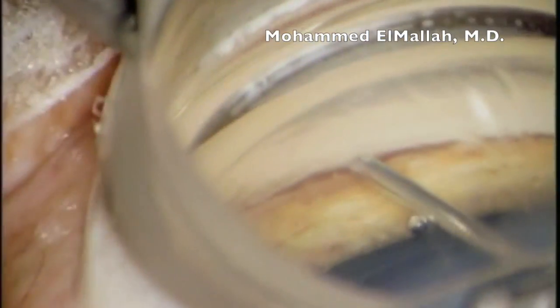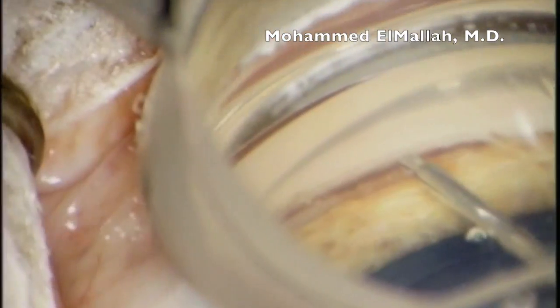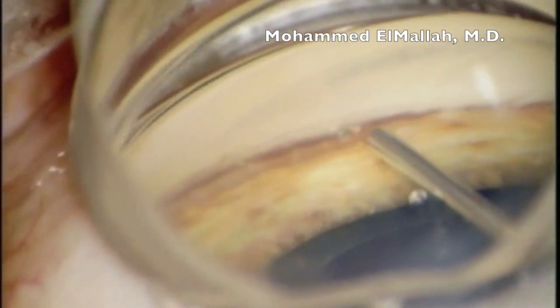I would also advise that you be careful not to hyperinflate the anterior chamber, as this will collapse Schlemm's canal and make it significantly more difficult to thread the device into Schlemm's canal.